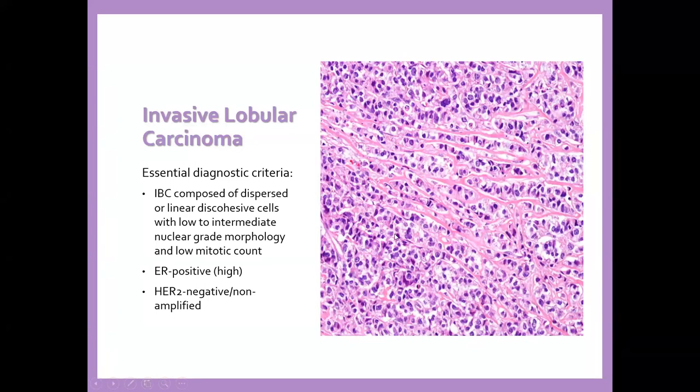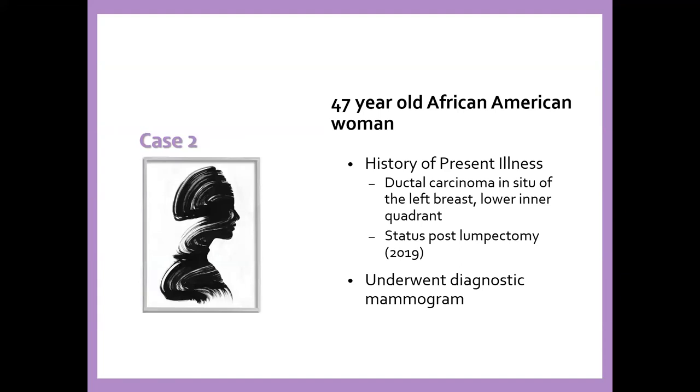You have the classical form of lobular carcinoma, where there is much less atypia. If you see more pleomorphism, some signet ring appearance and some mitoses, you need to think about the pleomorphic type of lobular carcinoma, which is very different and often behaves like ductal carcinoma. So that's infiltrating lobular carcinoma.